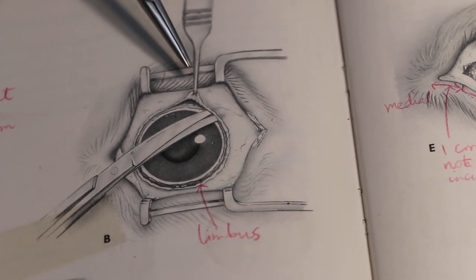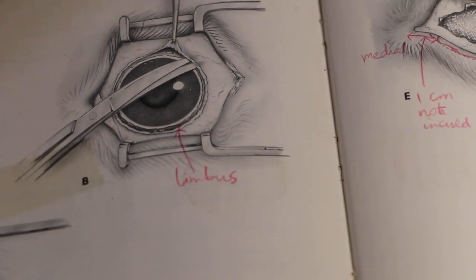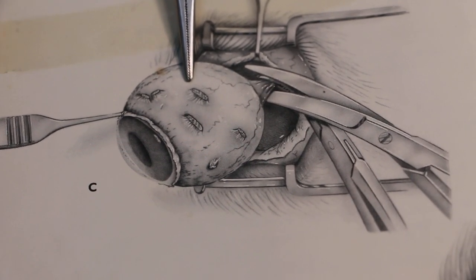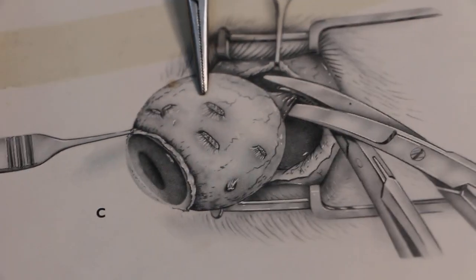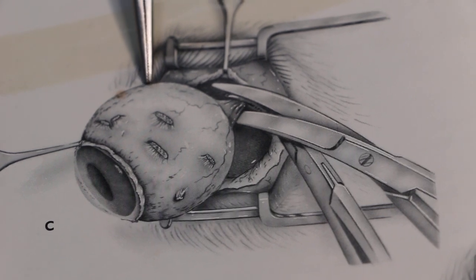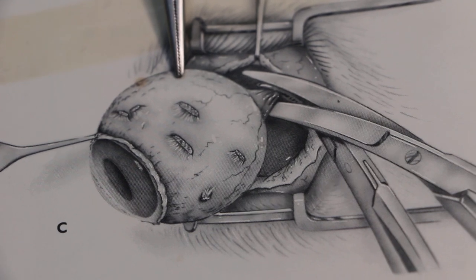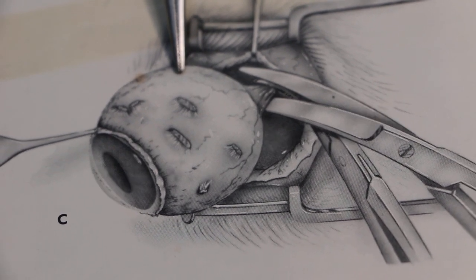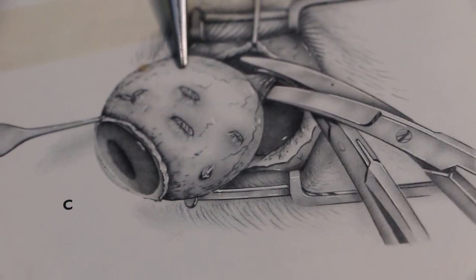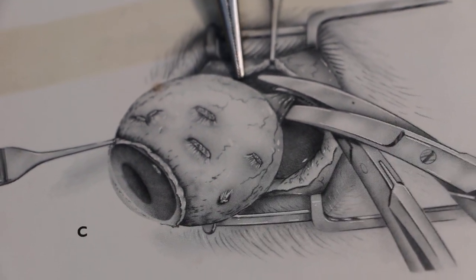Lift it up and cut the conjunctiva. The third part is to slowly cut off the muscles all around the globe so that the whole eyeball can be pulled out a bit, but not too forcefully — otherwise it will affect the optic nerve and the other eye's eyesight. I use electrosurgery to slowly dissect out the eyeball all around 360 degrees.